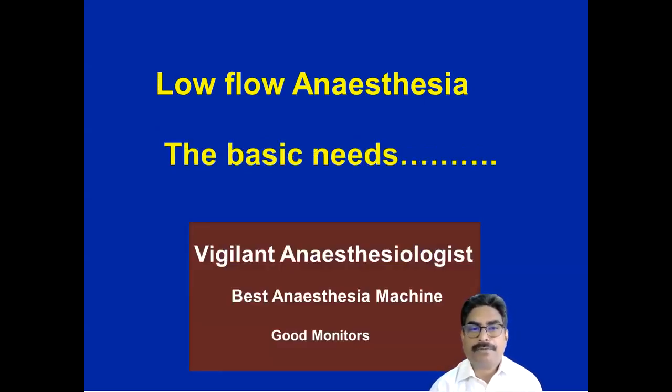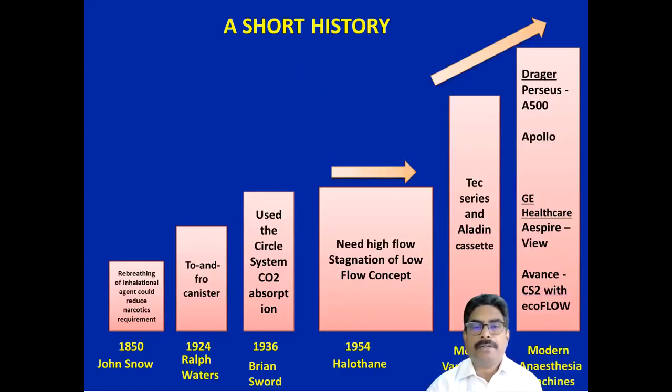So what are the basic needs for a low flow anesthesia? We need a vigilant anesthesiologist, best anesthesia machine and good monitors to perform a low flow anesthesia. So let us walk through the history of low flow anesthesia.